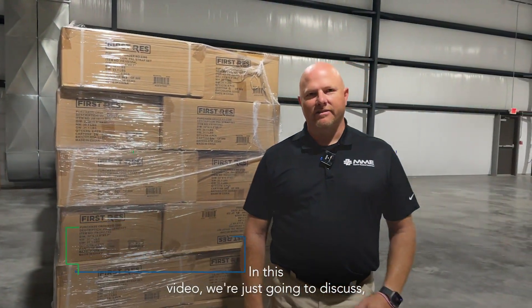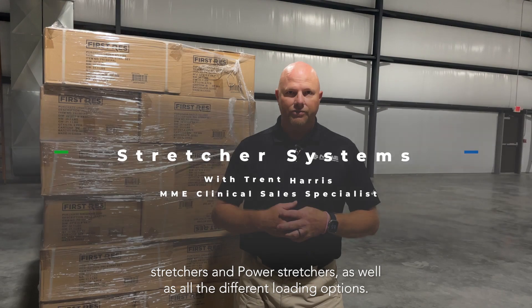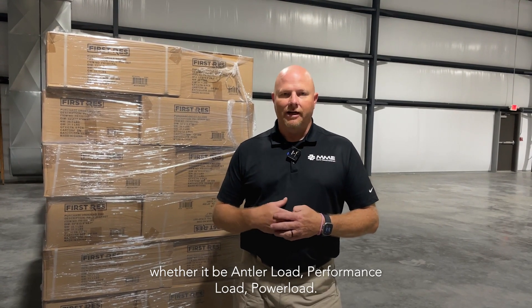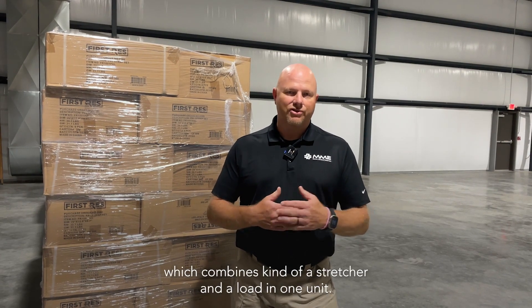In this video we're going to discuss different types of Stryker stretchers — manual stretchers and power stretchers — as well as all the different loading options, whether it be antler load, performance load, or power load. We will also jump over into the INX stretcher, which combines a stretcher and a load system in one unit.